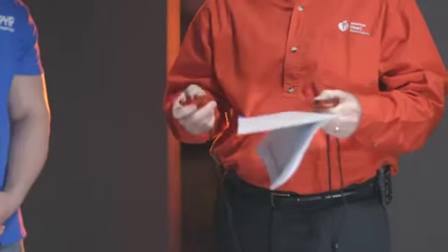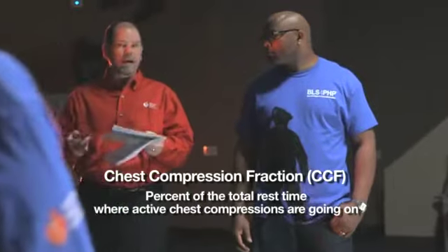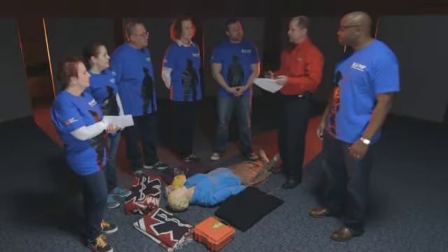You'll note that I have two stopwatches. I'll be gathering the chest compression fraction, which is the percent of the total resuscitation time where active chest compressions are going on. We've pre-identified Deb as the team leader — she's the captain on the fire engine.